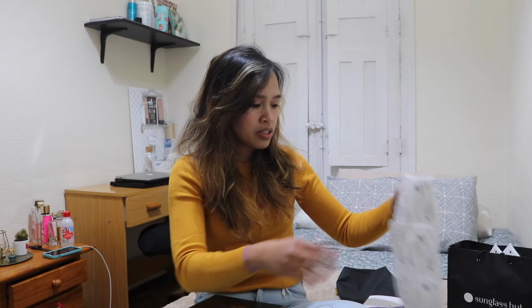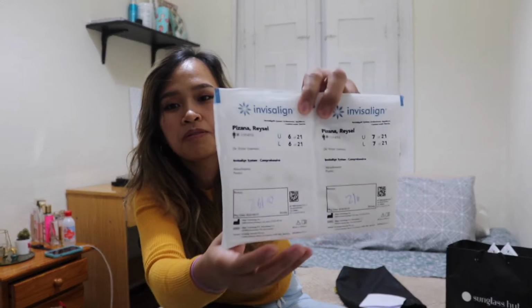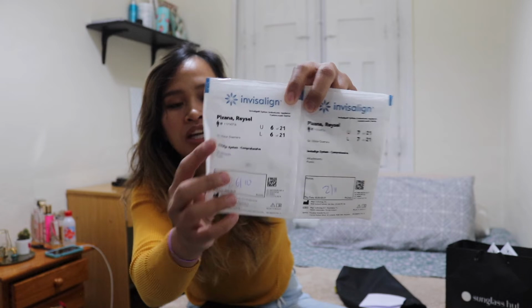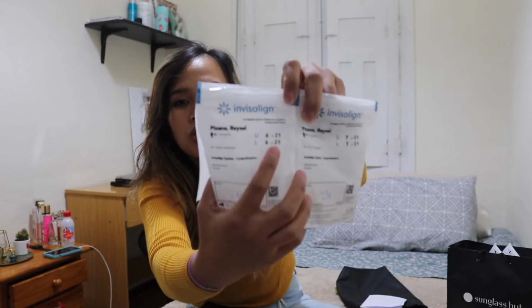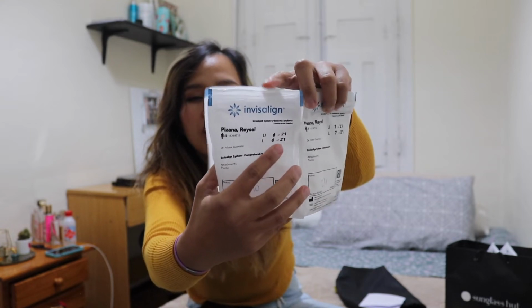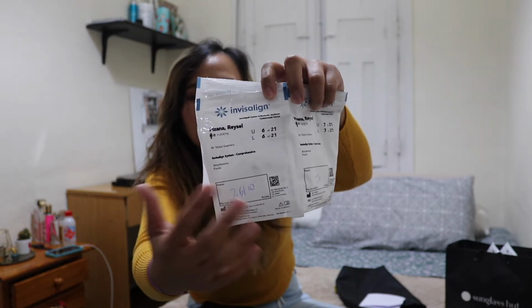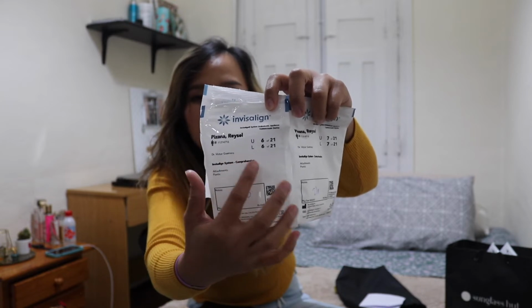So when you're given your liners, it will be shown here. This is my first set of liners, and this shows 6 of 21. It means this is the sixth set of liners, so out of 21, I'm still on 6. There are 15 more liners to go. My first set is 21 liners.